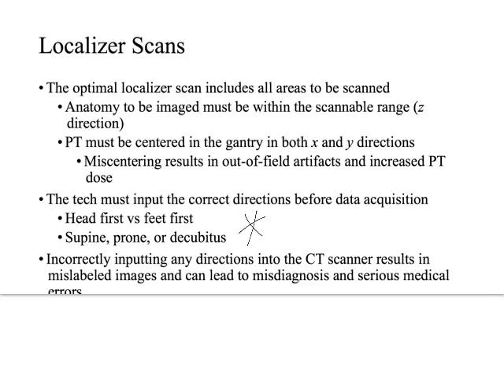That's why she makes such a strong point about that. So we're talking about medical errors and minimizing them just by rotating a little cartoon guy around. And she talks about some of the ways that we can avoid miscentering and stuff on page 40. Those are pretty helpful. Yeah, and I think that's all I need to say about localizers.